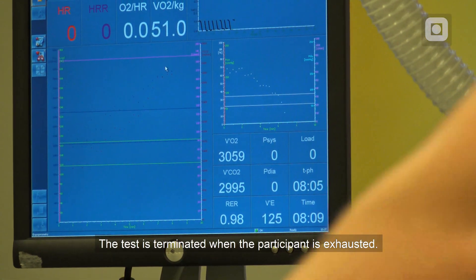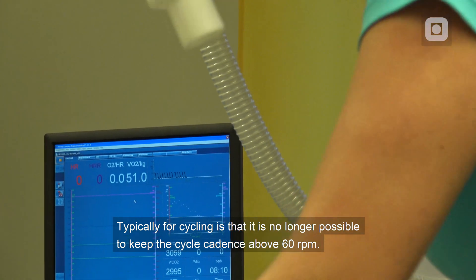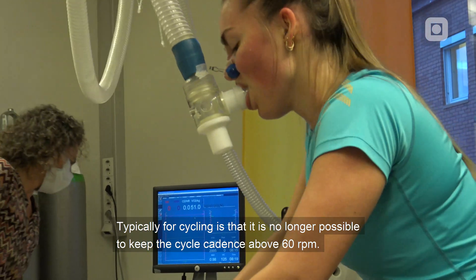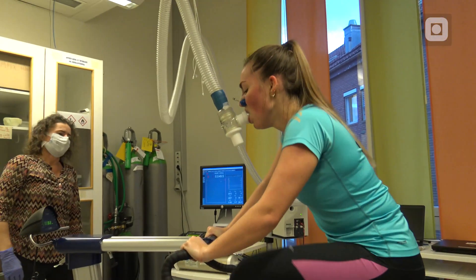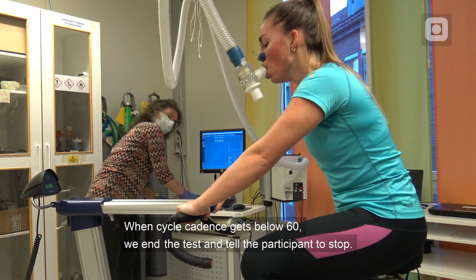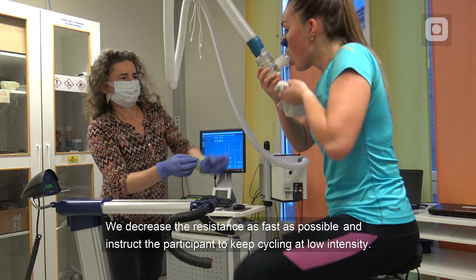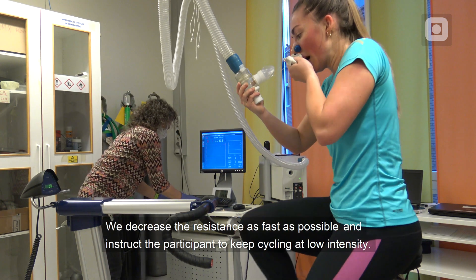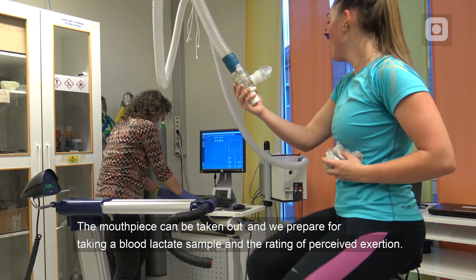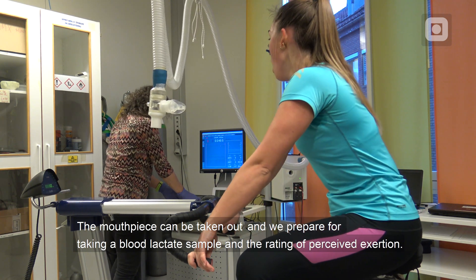The test is terminated when the participant is exhausted. Typically for cycling, it is no longer possible to keep the cycle cadence above 60 rpm. When cycle cadence gets below 60, we end the test and tell the participant to stop. We decrease the resistance as fast as possible and instruct the participant to keep cycling at low intensity. The mouthpiece can then be taken out and we prepare for taking a blood lactate sample and the rating of perceived exertion.